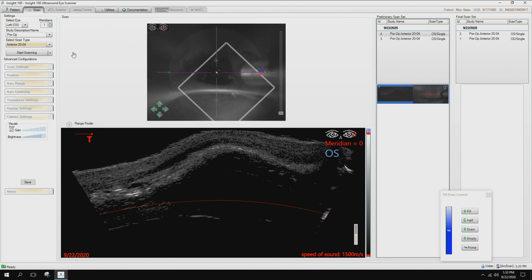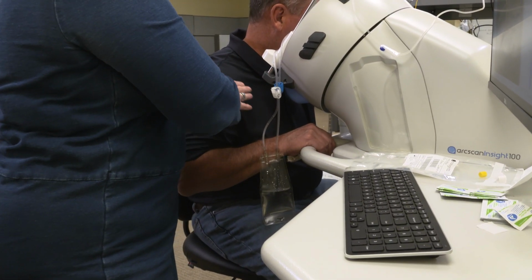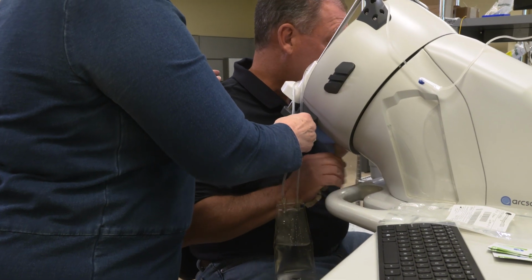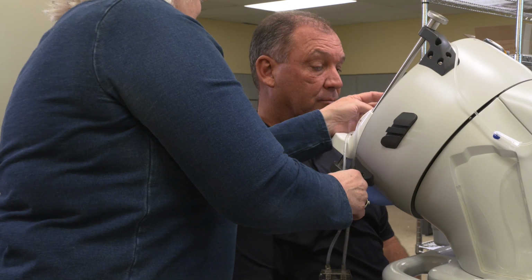I understand that you want to have patients moving through the clinic quickly, and there's a lot of pressure on you to have the patient workflow be uninterrupted. However, it is altogether more important to get a good quality image, and with a little practice, you should be able to get an easy image first every time.